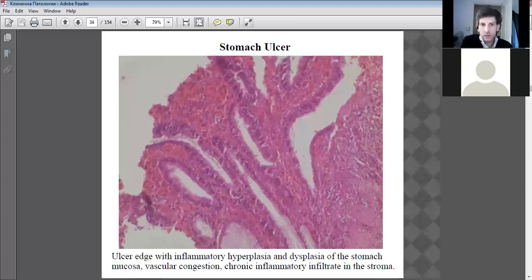There are lots of exposed tissue. Okay, normally this would be a round, curved-like structure, but it's being eaten away, if you like. There's also the formation of quite a lot of spaces as well. So the ability of these cells to produce their secretions has been lost.